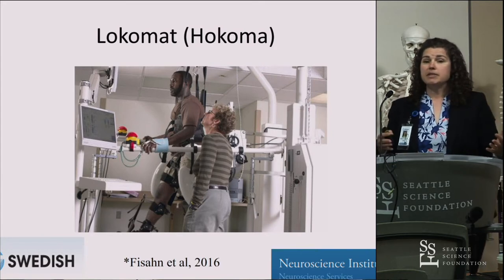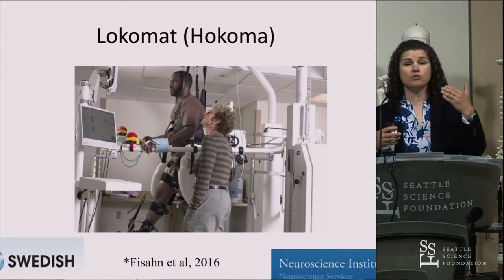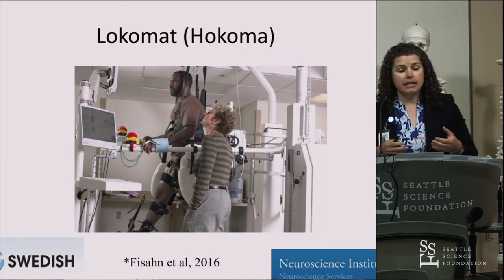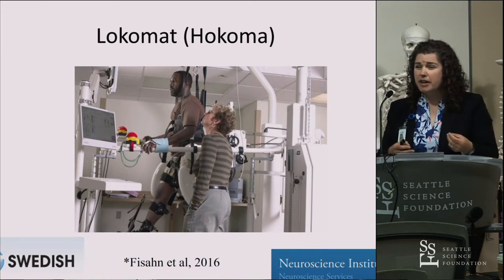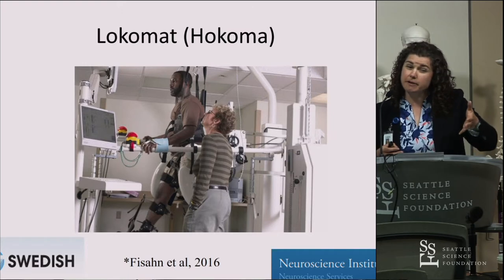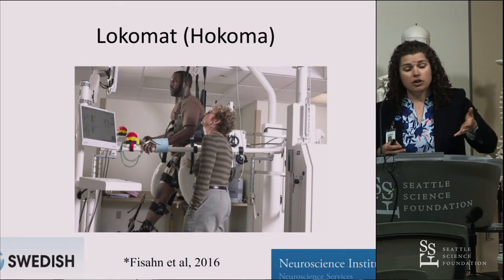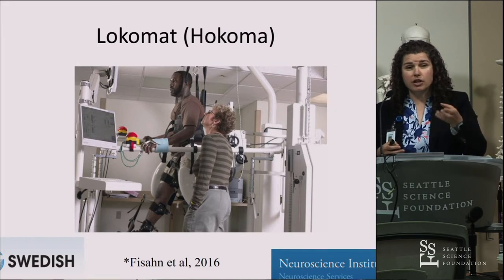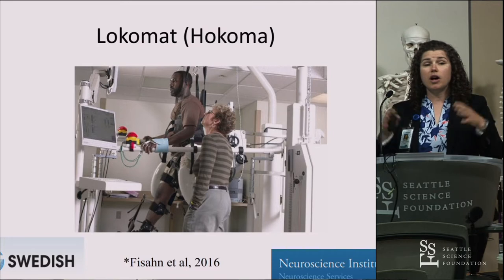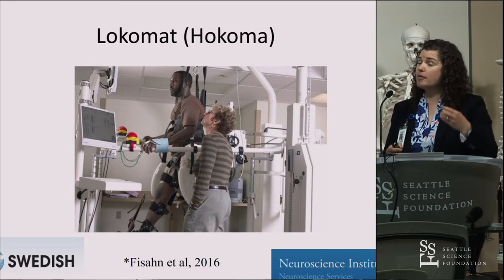Now, the question comes in is, are we losing focus? How much work is the patient really having to do when they've got this passive robot? And the ability to assess that as a physical therapist is a little bit easier with a manual limb advancement, because you can feel what the patient's doing and you can adjust your support in that moment, your verbal cues, your tactile cues.